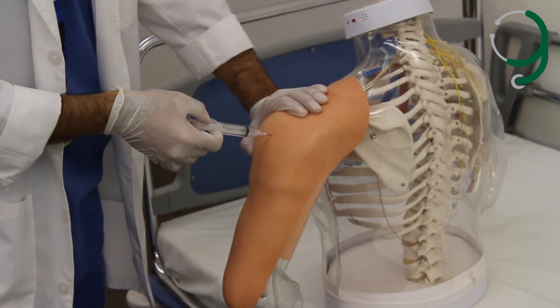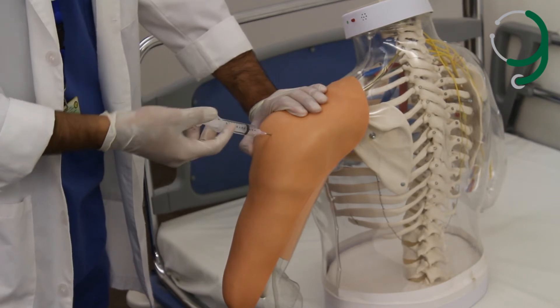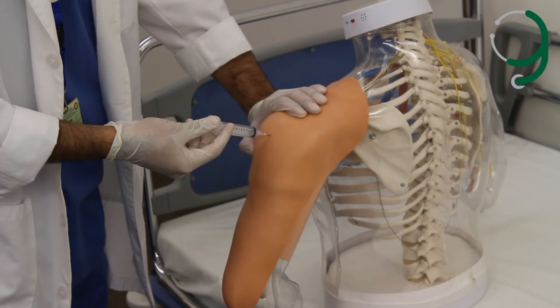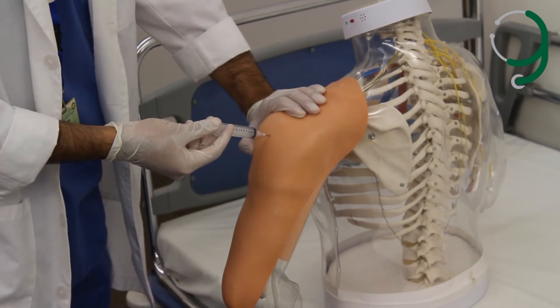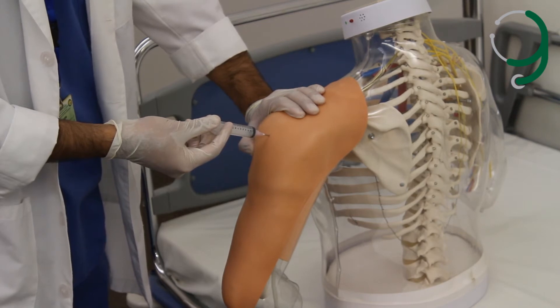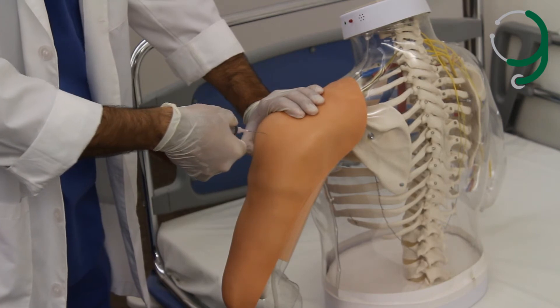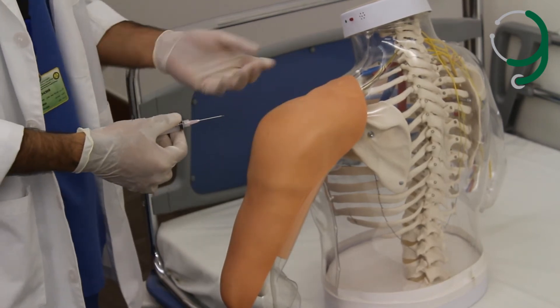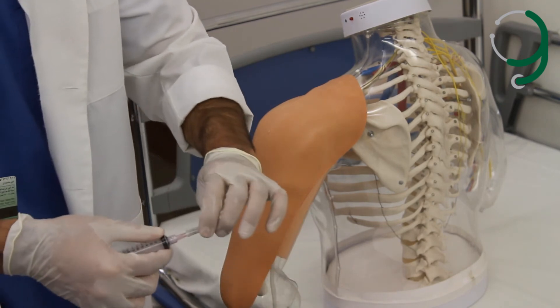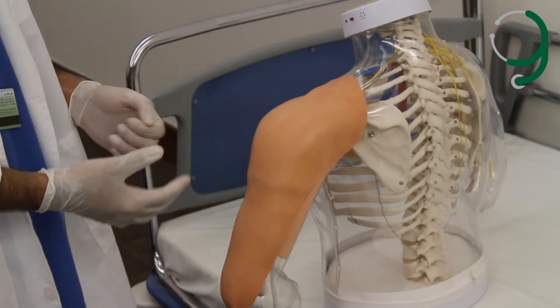We aspirate just a little bit to make sure that we are not in a blood vessel. Then we inject the medication slowly. We wait for 10 seconds, then we draw the needle out and release the non-dominant hand. We wipe the area again and put a plaster if needed.